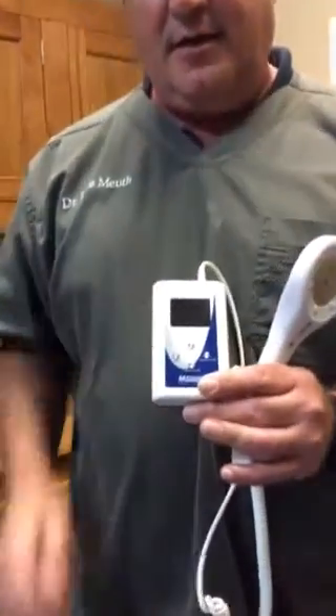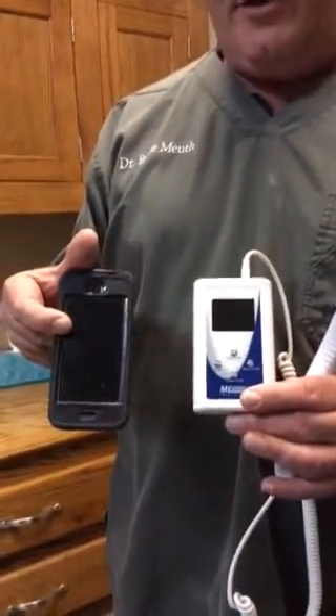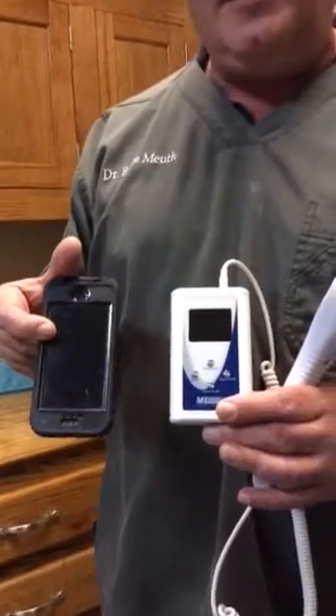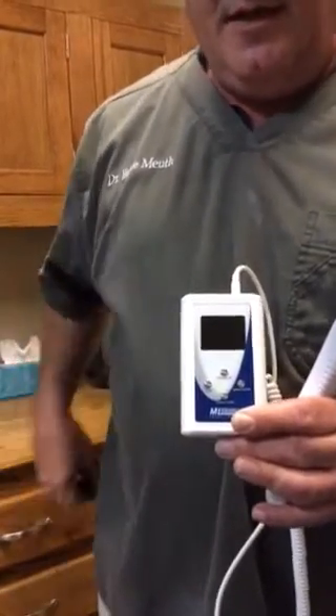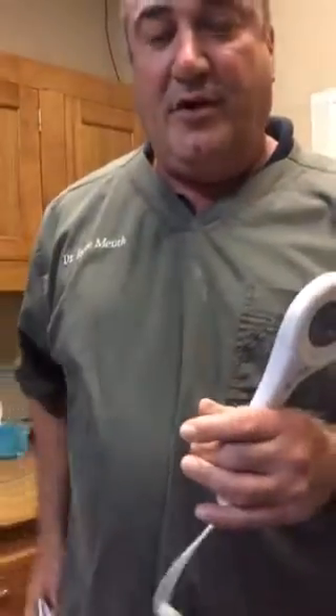The great thing also about the new Microlite is the size. Here's a cell phone to compare it to — you can see it's approximately the size of a cell phone. It's so easy to transport and move. You could even put it in your pocket when you're treating a dog.